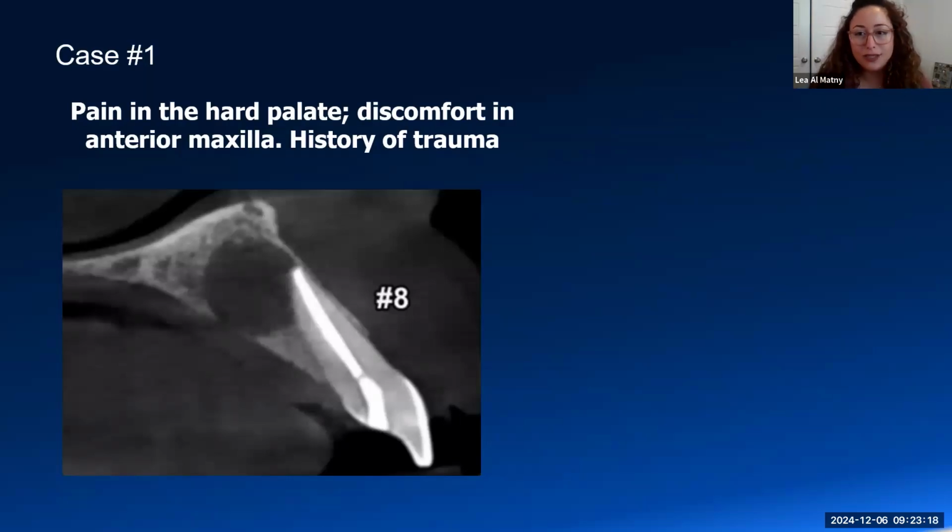Second thing we're going to do is look at radiation exposure, because it is one of the most common questions that we get. So at what point is it okay to switch between 2D and 3D? Am I subjecting the patient to more radiation exposure? So we're going to talk about that.